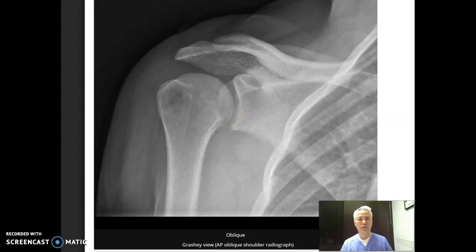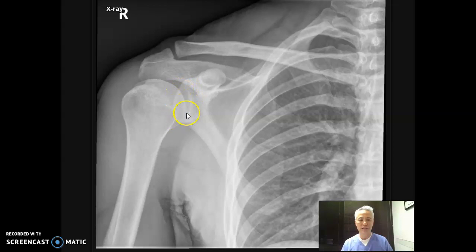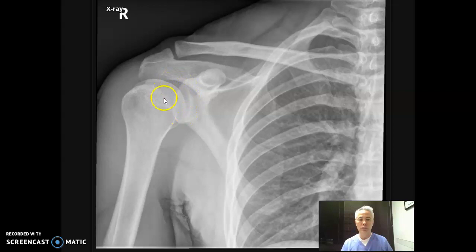You should look at your external or internal rotation view and look from the glenoid space to the ribs — this will tell you how much space you have to work with. If there's quite a lot of space, you could turn this patient to about 45 degrees, or even up to 50 degrees, and still not have it overlap the ribs. If you don't turn it enough, the oval will shrink and become more narrow. If it's really circular — more round than oval — you probably need to oblique the patient a bit more than normal, closer to 45 to 50 degrees. The range is pretty much 35 to 45 degrees for most patients.